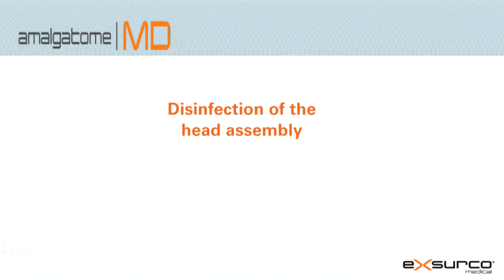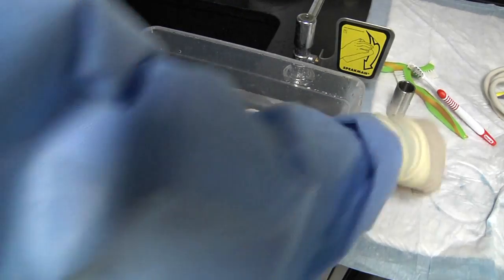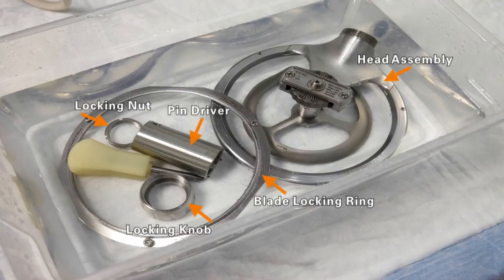Disinfection of the head assembly. Prepare a neutral pH or instrument safe enzymatic cleaning solution, immerse the head assembly, blade locking ring, locking knob, locking nut, pin driver, and screwdriver, and let soak according to solution manufacturer specifications.